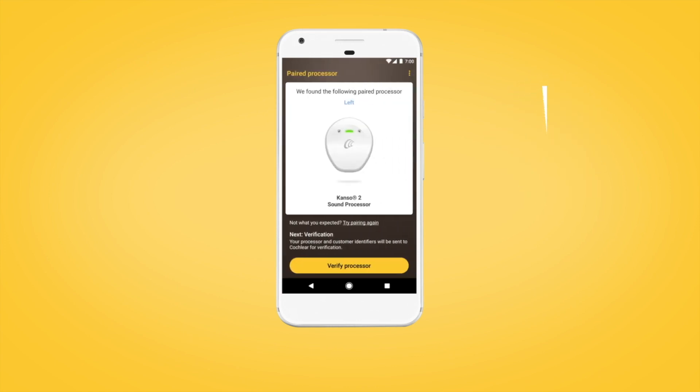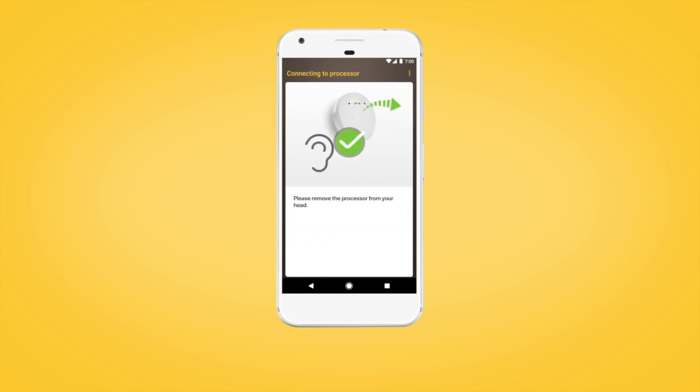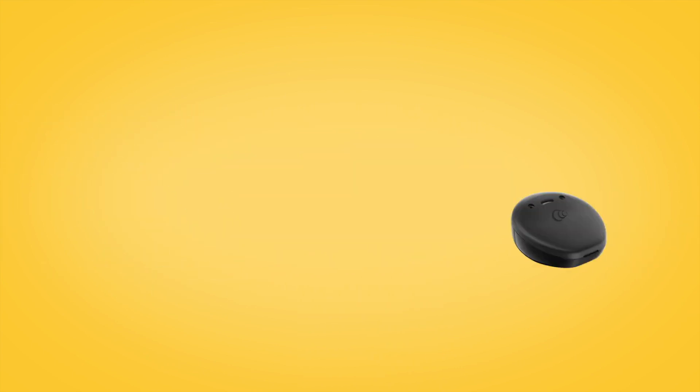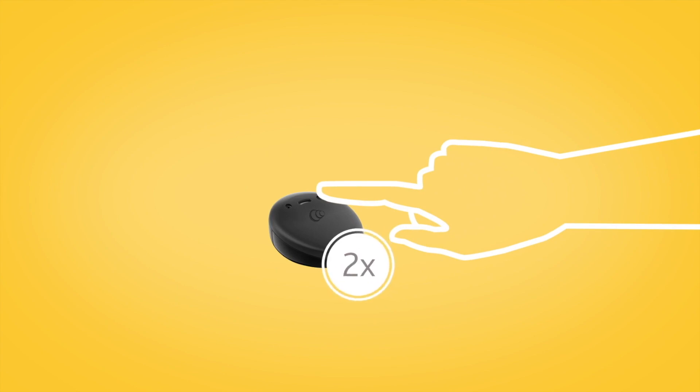The next step is to verify your sound processor. Tap Continue, then remove your sound processor from your head. Briefly press the button on your Nucleus 7 sound processor, or if you have a Kanso 2 sound processor, tap it twice.